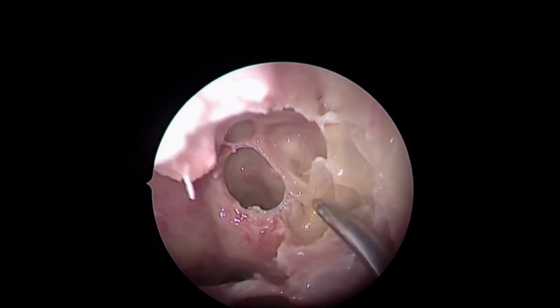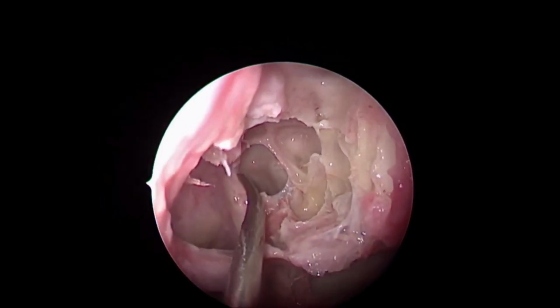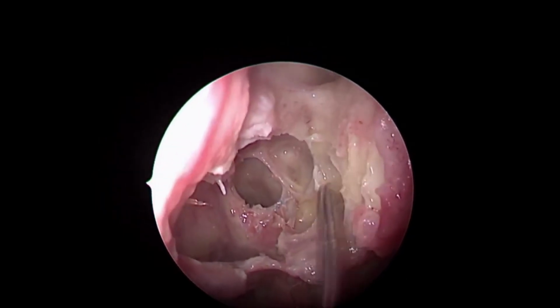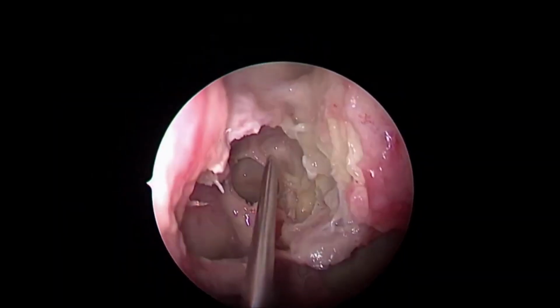So this is our submission to use this approach. Before doing a posterior ethmoidectomy, go medially and see the sphenoid sinus, making it your posterior limit, then do the posterior ethmoidectomy, and then go ahead with the sphenoid widening to prevent injury.